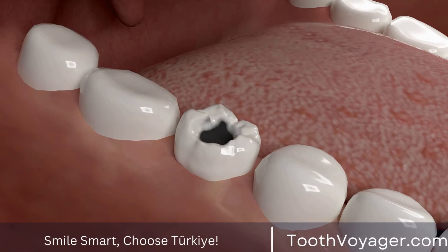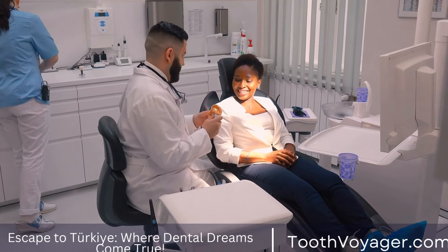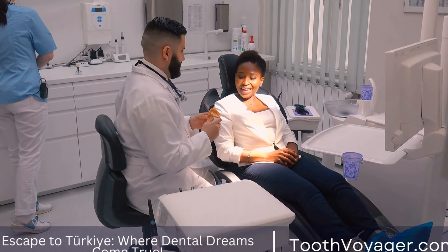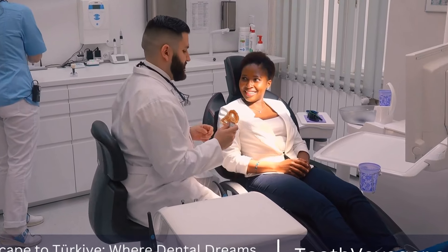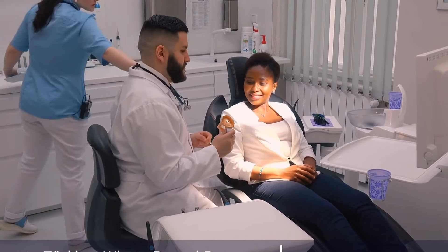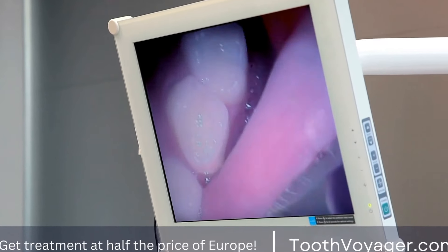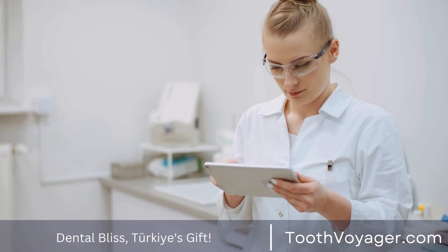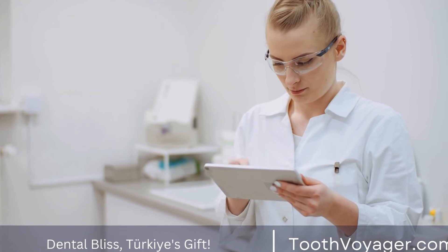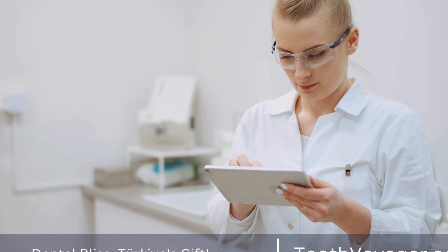Step 2: Anesthesia. After the diagnosis is established, the next step is to anesthetize the area surrounding the tooth using local anesthesia. This will ensure that you feel at ease and free of pain during the entire procedure. The dentist may also place an elastic dam on the tooth in order to keep it dry and clear of any saliva during the procedure.